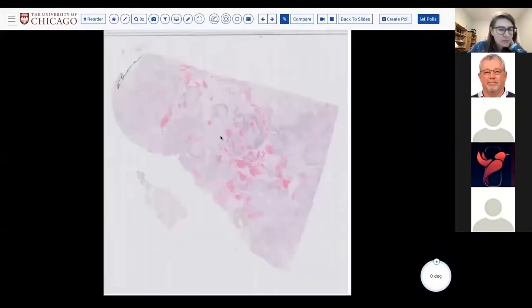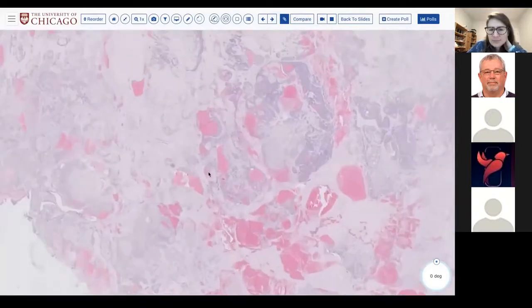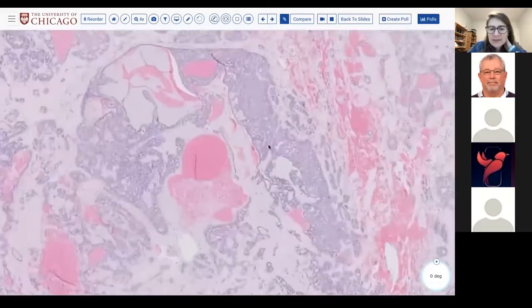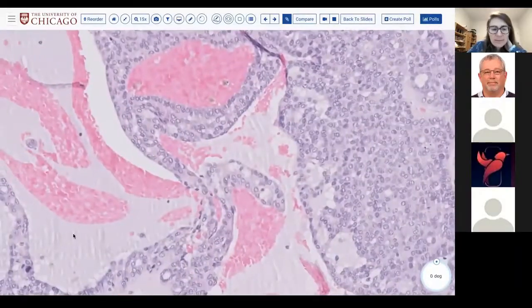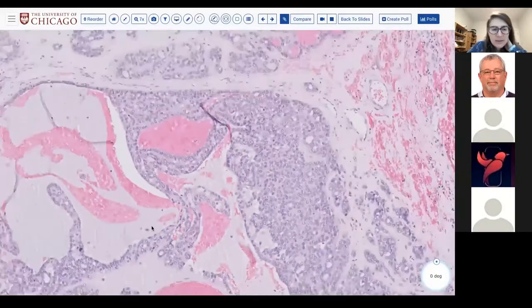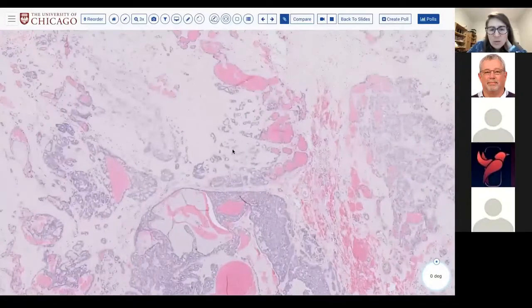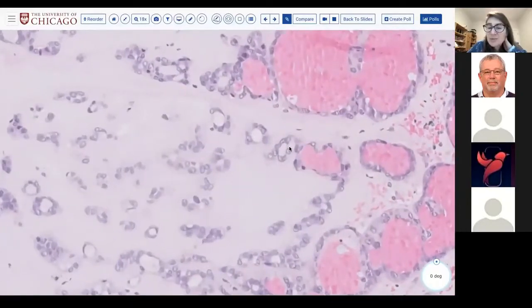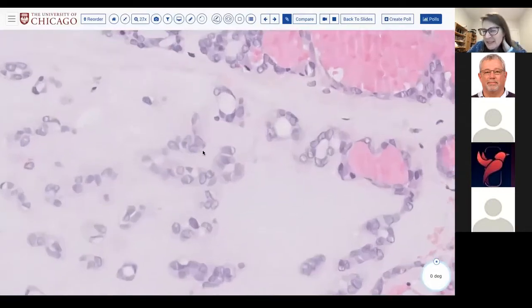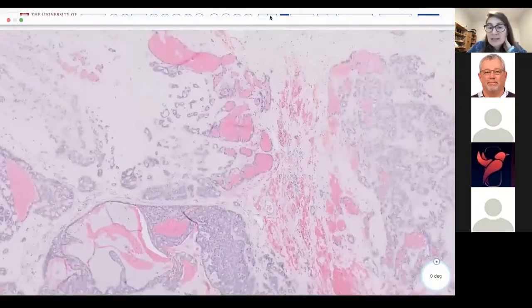However, here's the H&E, again showing these variably cellular areas with some microcystic mucoid spaces with some duct-like structures, but I would argue that I do not see a squashed layer at the base of some of these duct-like structures. So are they really bilayered ducts? Is it a PA? Well, let's see what our stains show.